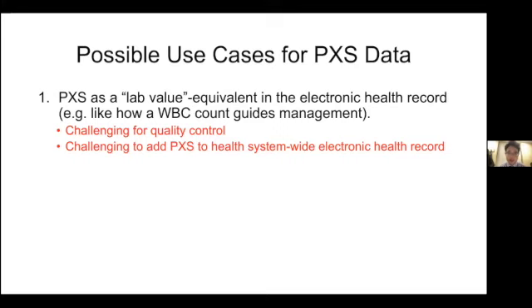One is the issue with quality control. I just talked about the series selection issue, and we didn't have a good system for checking if the wrong image had been sent over. Obviously, if a lateral chest radiograph gets sent over to the model, the AI model is not going to give you necessarily an accurate result.